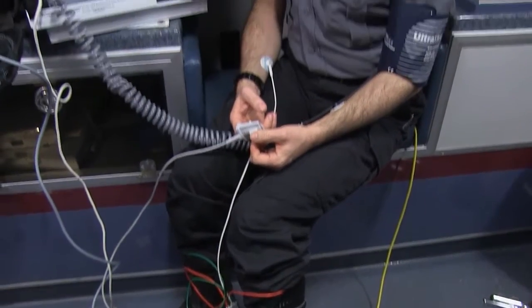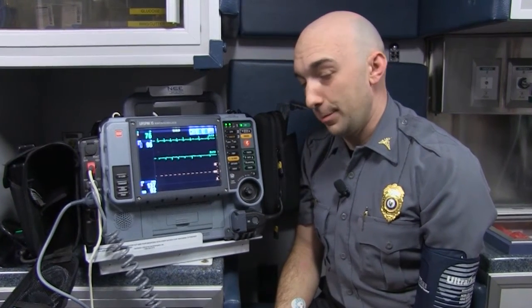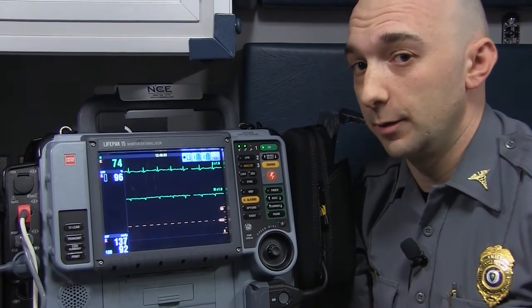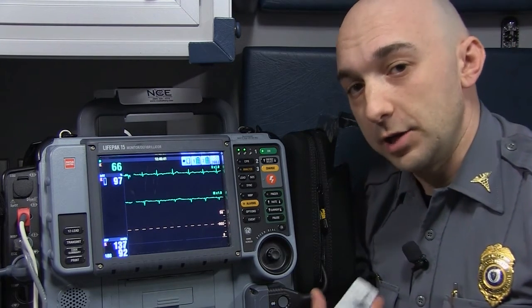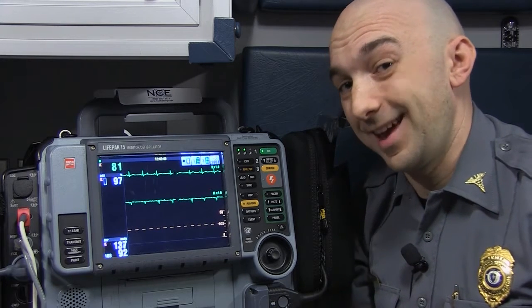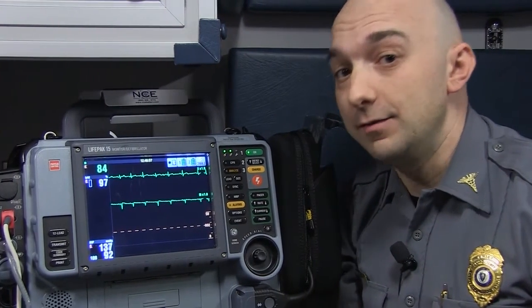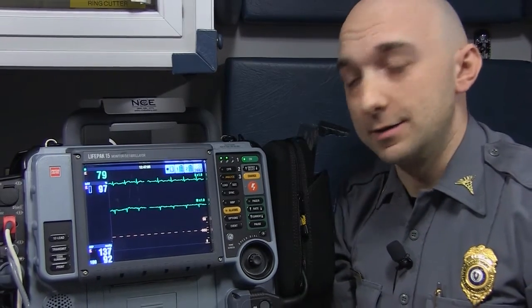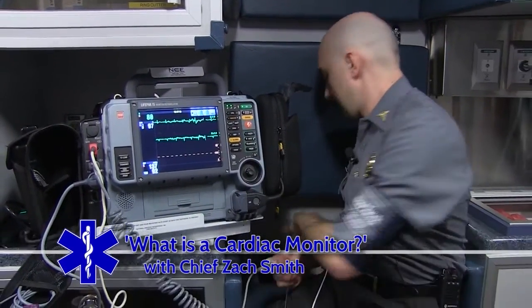On the screen you can see those little blips — that's the electrical activity happening in my heart right now. As a paramedic we can see those blips, interpret them, and know exactly how healthy someone's heart is electrically. When somebody has a fast heart rate we see more blips. If somebody's having a heart attack, we attach more electrodes to their chest and take different views of the heart to tell exactly the spot where that heart attack is occurring. Based on those findings we give different medications — something paramedics are trained to do that EMT basics aren't.